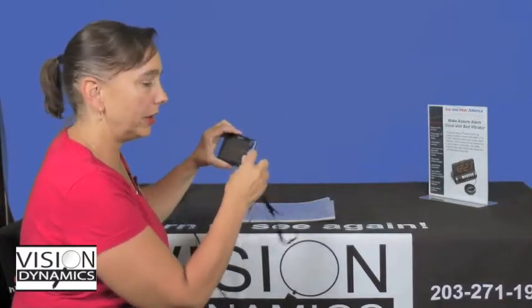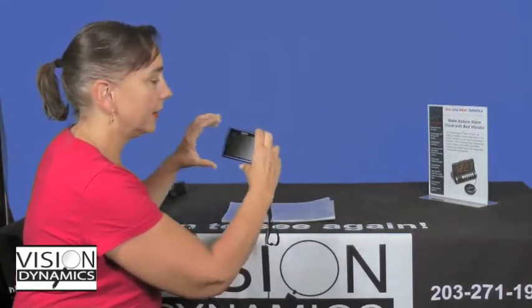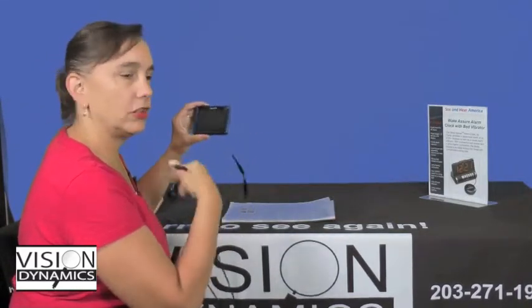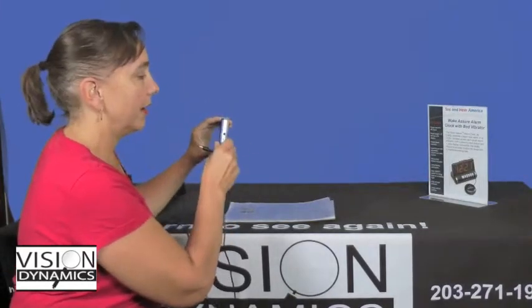You can use it while it's charging, while it's plugged in. If you're sitting close to the plug, you can go ahead and be using it if you'd like. There's no harm to it. You may want to just get into the routine of every evening when you're done using it for the day, plugging it in and letting it recharge overnight. You can't overcharge it, so you don't need to be worried about that. And just kind of get into that routine.